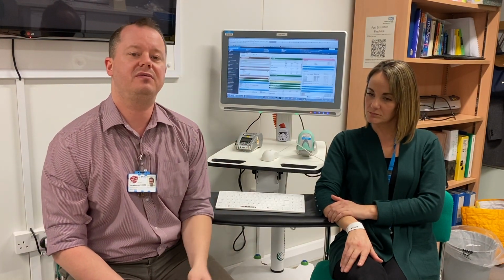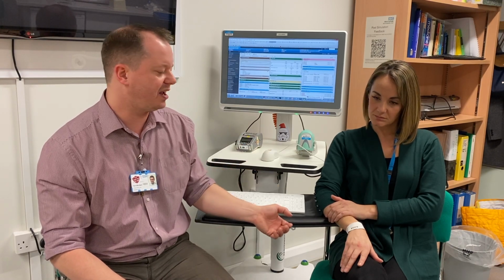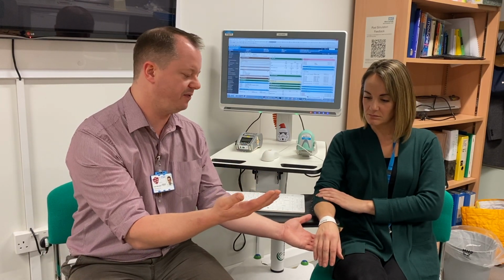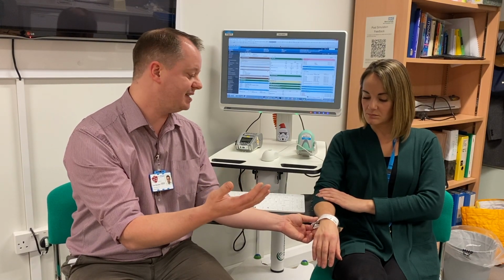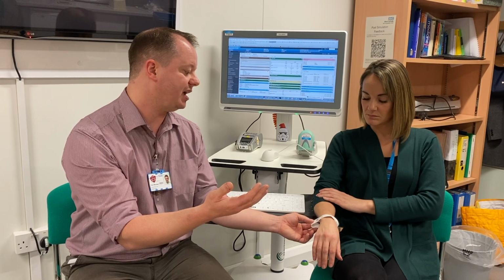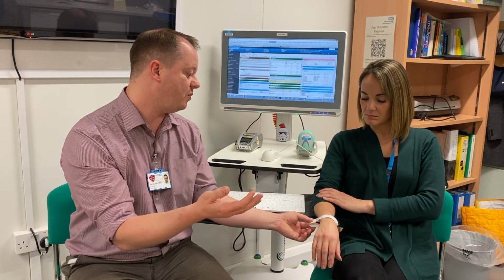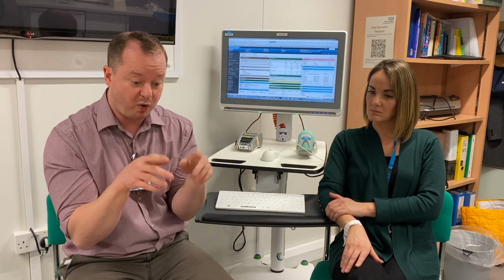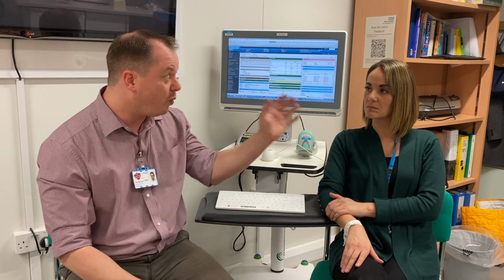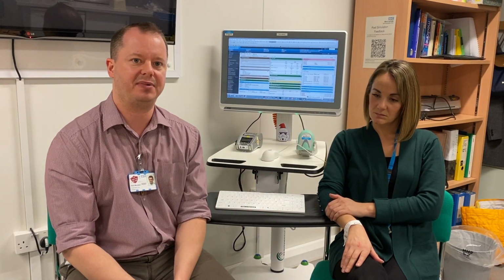Next, if we were using a paper form, we would do a visual check, and I would compare the paper form to the wristband that I've got in front of me. I would check the name, the date of birth, and I would also check their hospital number, what we call the MRN number, and that is 2016375 for this person. I would make sure they're all correct. So I know I had one form with the patient's details on, one patient in front of me, and I'll just be doing one blood sample and test on that patient.